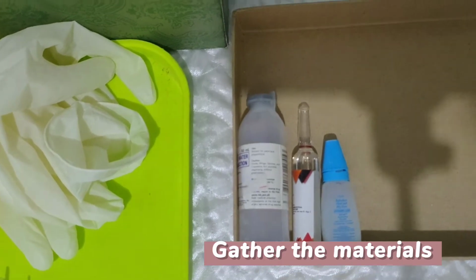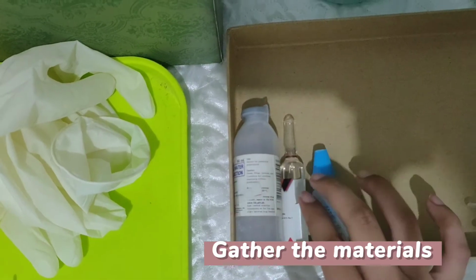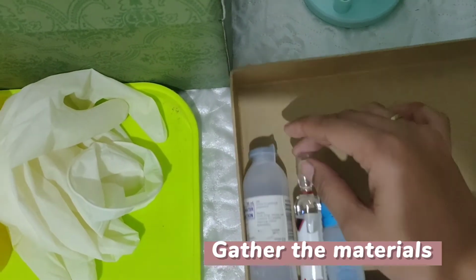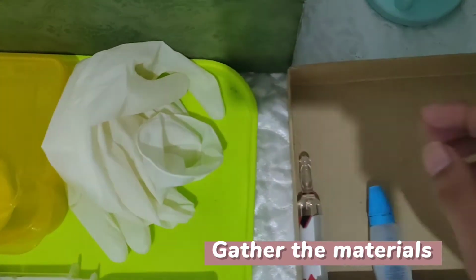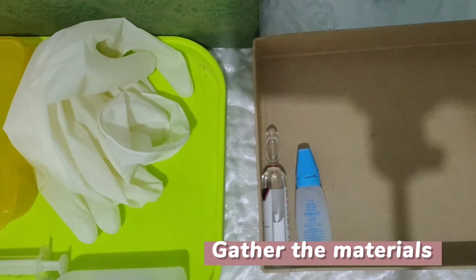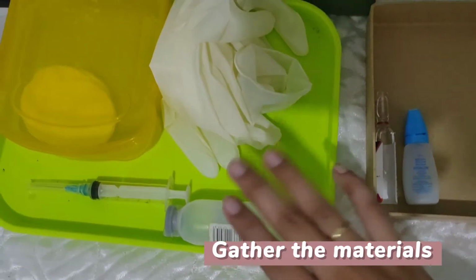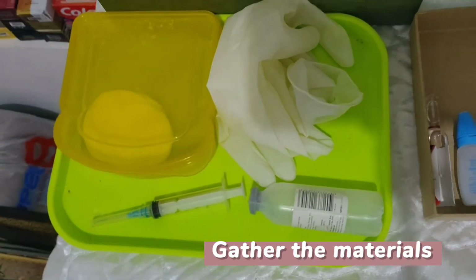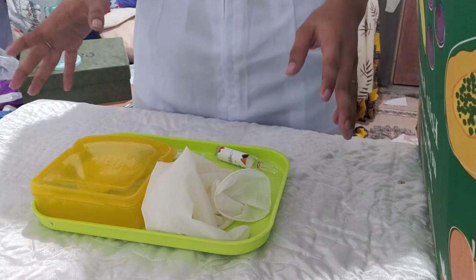Now we will check the label on the medication before picking it up. We will assume that this is the medication. Okay, so this is the medication. After that, we need to check the label again before calculating and preparing the dose. So we need to check the medication again. Let's start. Now we will prepare the medication.